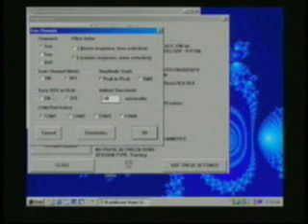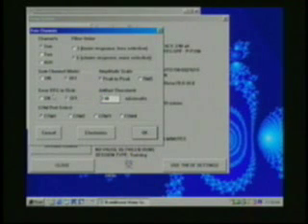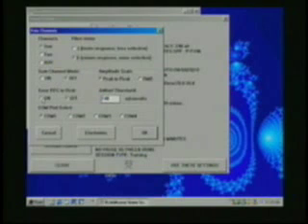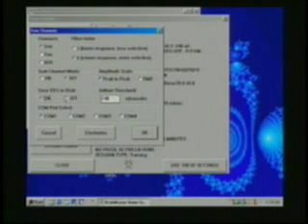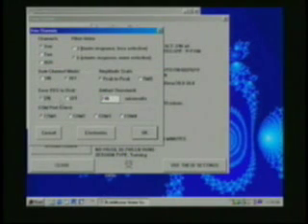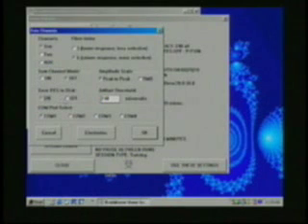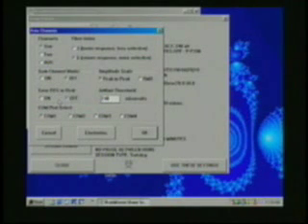Then we have save EEG to disk which allows us to save the EEG waveform to the disk. You can turn this on if you want in order to record the EEG for your later review, however keep in mind that it will store a lot of information and files will get large. So for typical training purposes we'll leave that turned off.